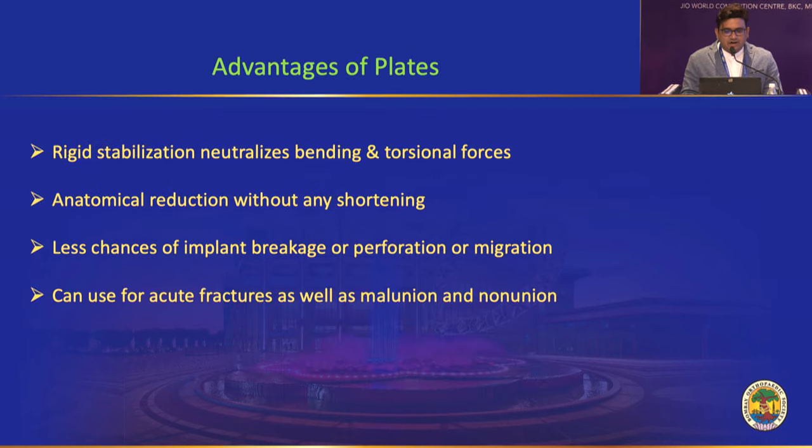So what are the advantages of plate? It gives a rigid stabilization, neutralizes the bending and torsional forces. The anatomical reduction is possible without any shortening. Less chances of implant breakage or perforation or migrations, and can be used for acute fracture as well as malunion, non-union cases.